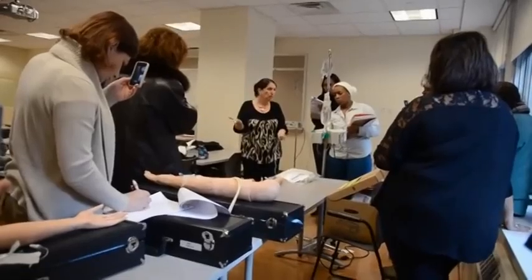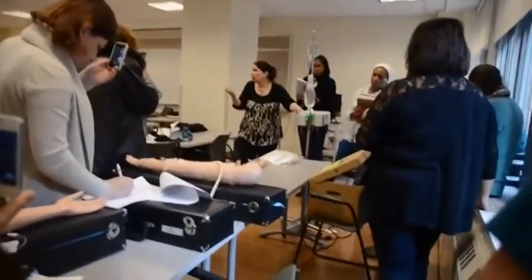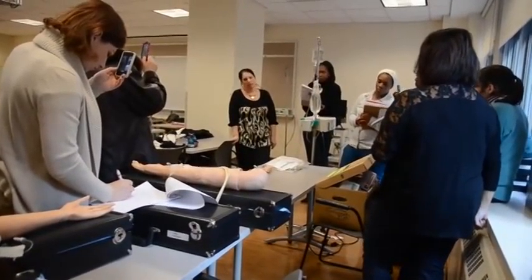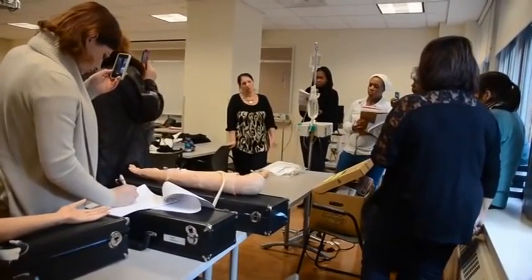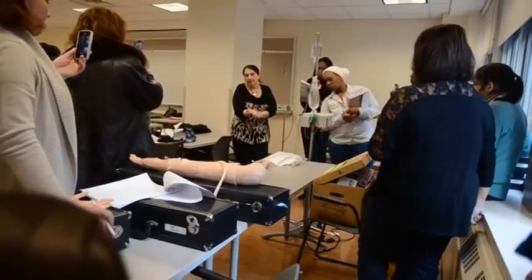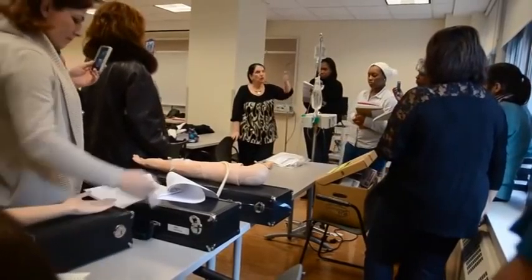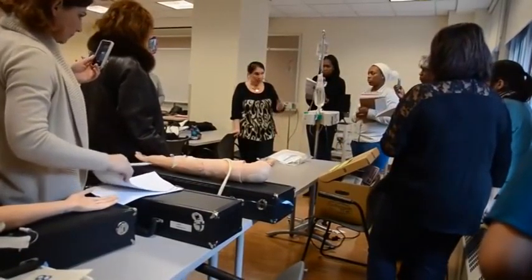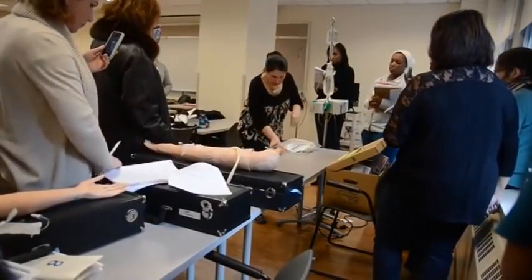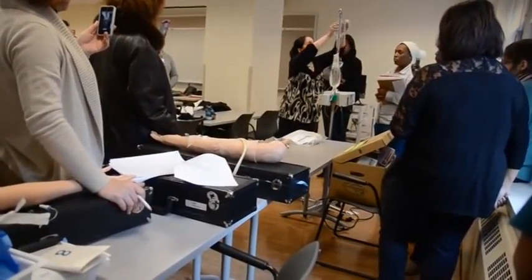You may have an instructor who says they want it in 45 minutes — I usually say 30 to 60 because that's normally what it is. We're not going to ask you why it would be 30 or 60 — it depends on the drug. Some patients find it painful, and then we make it 60 instead of 30 minutes. And that's it — the two of them are running at the same time. Come back, it's done. Close it, disconnect it, do everything you have to do, reassess the site, and put this back up for next time.